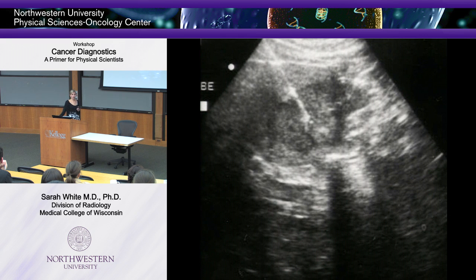So here's ultrasound, okay? How do we get to these lesions? We put an ultrasound probe on. Can I see it? Yep, we could see it, and we just put a needle into it. So how do I know I'm in? Because I'm watching. Okay, ultrasound is real time. As I'm advancing the needle in, I can see it go. I can see that I'm in the middle of the tumor, and we get the diagnosis. So this patient had carcinoid.